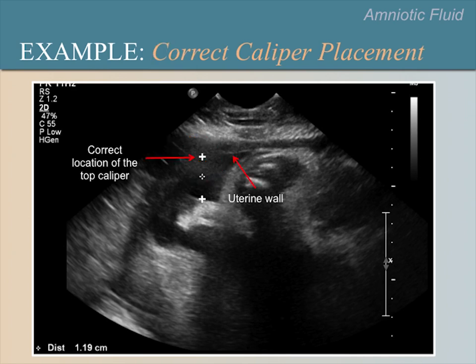Here are examples of correct caliper placements measuring the vertical heights of amniotic fluid pockets. Please take time to look at these images now by pausing the video. In the lower-left image, notice that there is a loop of cord but the measurement is taken next to it, and the vertical line between the calipers does not cross the cord.